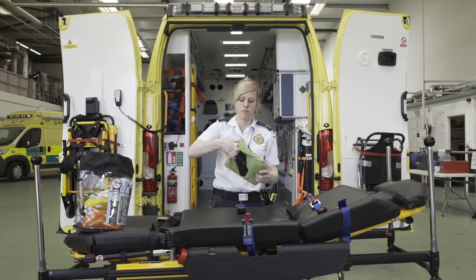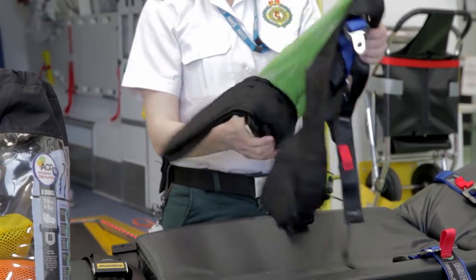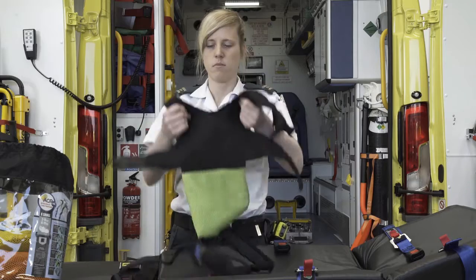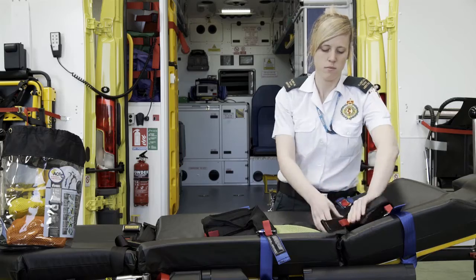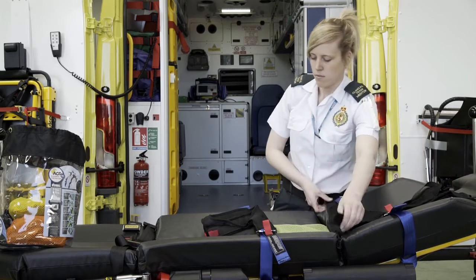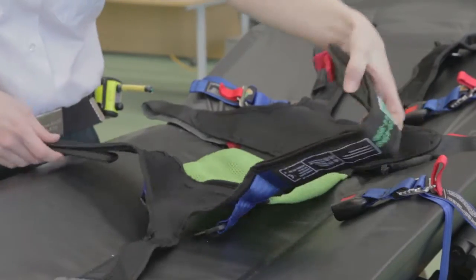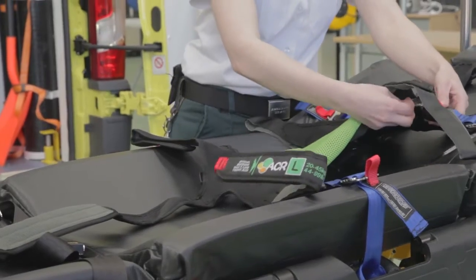Open the ACR with the label facing away from you. Open so the restraint is fully exposed and ensure the chest strap buckle is unclipped. Now lay the ACR on the mattress with the bed mount strap buckles facing down and the crotch strap pointing towards the bottom of the cot. Click into place the buckles on the bed mount strap to the ACR harness.